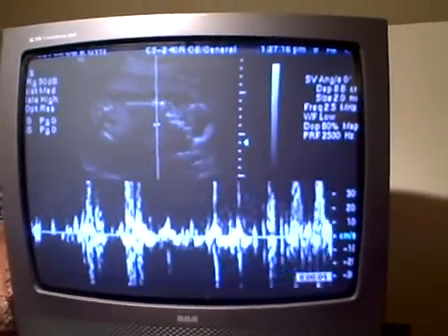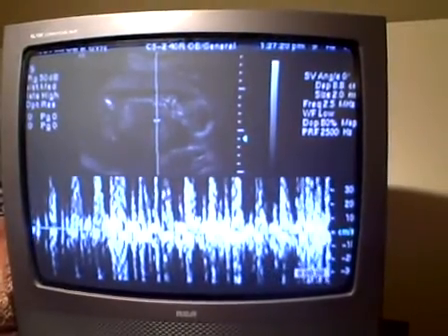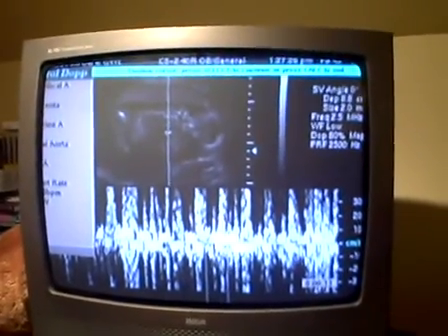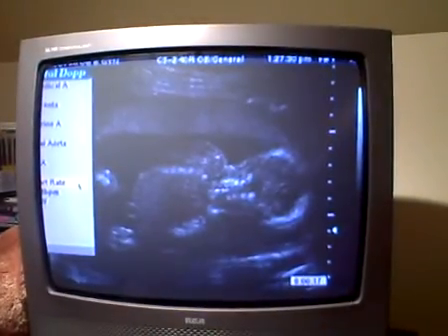That's showing the heartbeat. You can see the baby kind of toward the top there moving, and it's not very clear. This is her, the ultrasound technician, figuring that out.